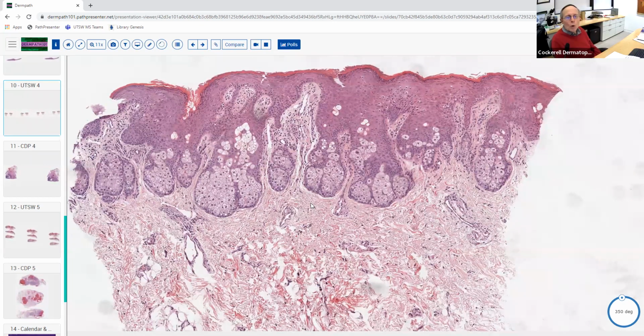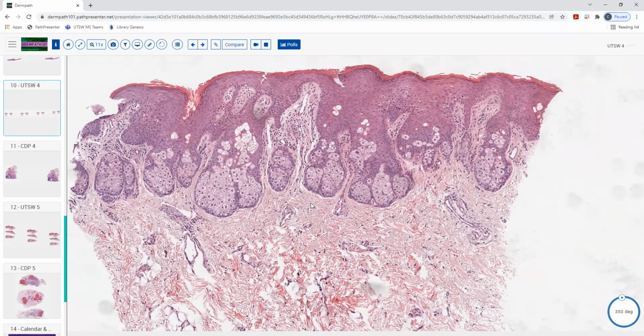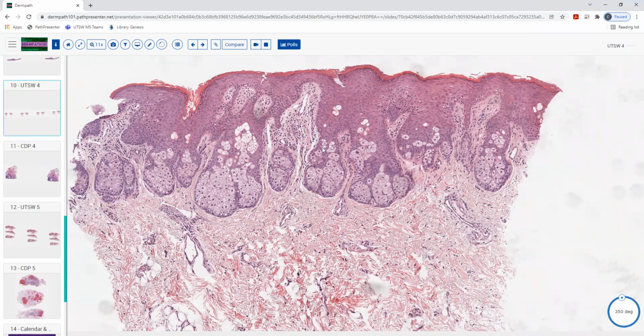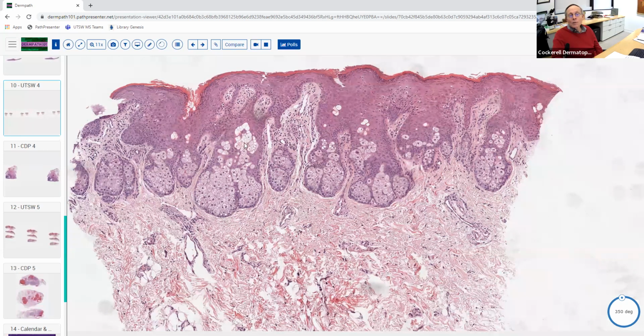Are these perfectly normal sebaceous glands? I mean, it seems like a lot. Yeah, I agree. I think there's a little bit too many. And it looks almost like some of the sebaceous cells are almost in the epidermis a little bit. Yeah. Which is kind of abnormal. Weird. Now, certainly it's not a malignancy, right? We're not worried about cancer here at all. But it looks like there may be some kind of a malformation here.